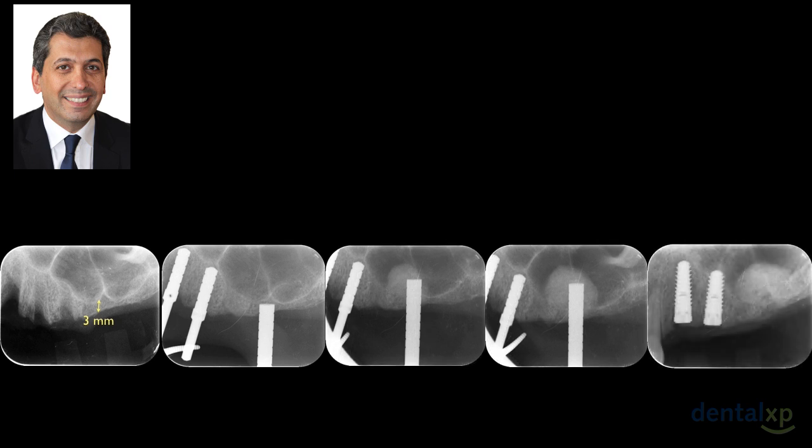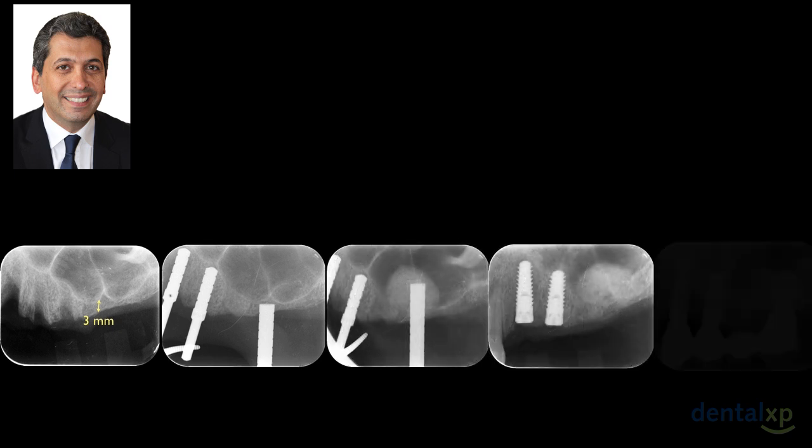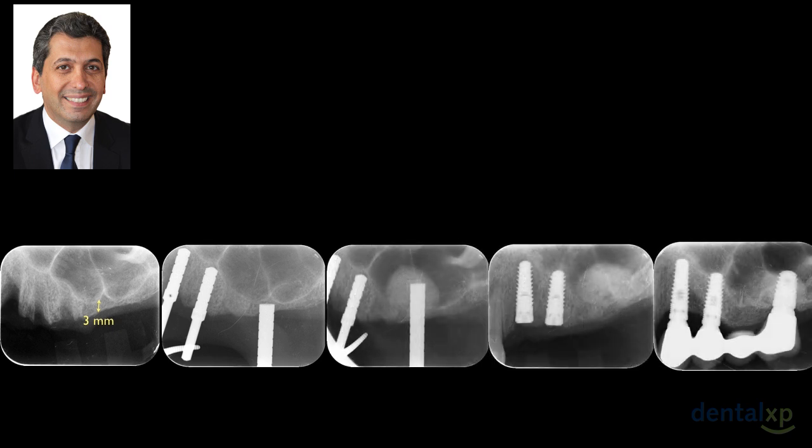This is the graft. We delayed implant placement in this case. This is 6 months later. We placed our implant, and after restoring the teeth and implant in function, you can see that it is also a very predictable technique in the long term.